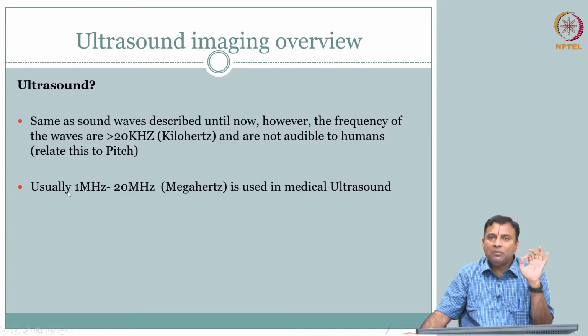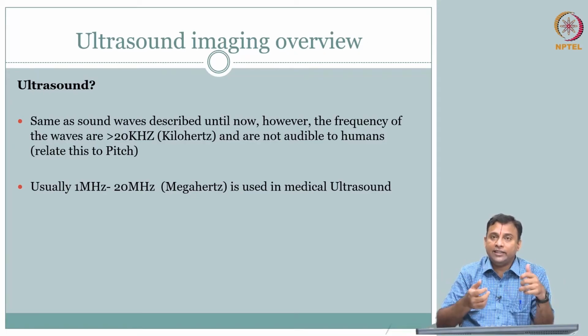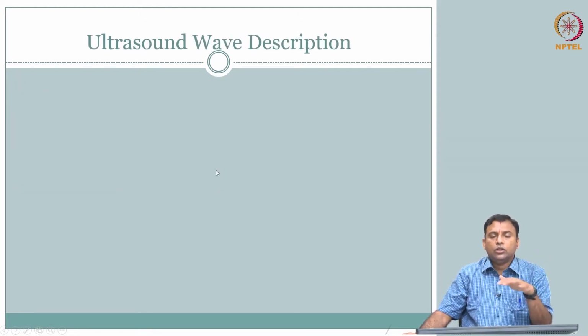In medical imaging, and in several other applications of ultrasound, such as the non-destructive evaluation that engineering firms do for quality checks on steel or concrete, or the whole area of non-destructive testing. If you are from a mechanical engineering domain, you probably would have heard of that. There they also use ultrasound, but typically in the kilohertz range, hundreds of kilohertz, whereas in medical ultrasound you are typically talking about 1 megahertz to 20 megahertz. So, higher frequencies.